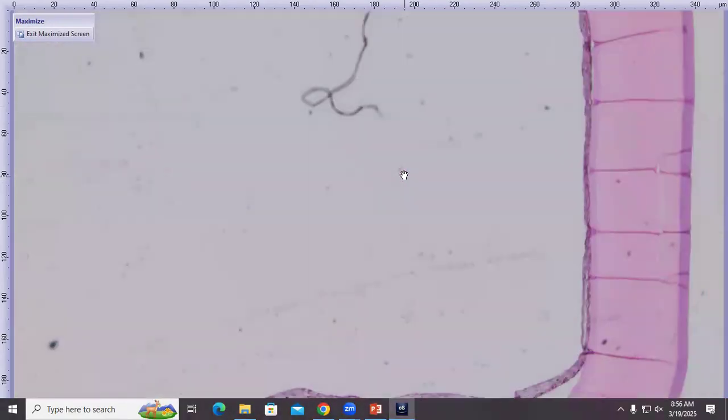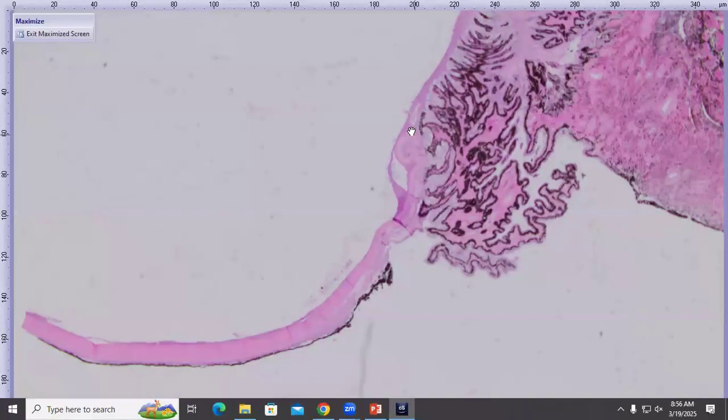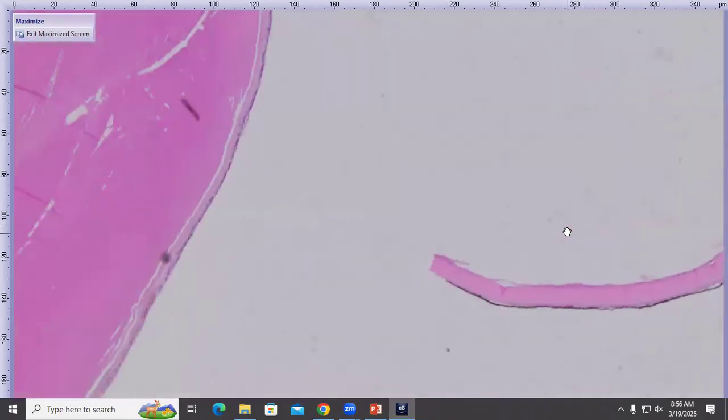If we walk all the way across to this side of the posterior chamber, you can see the other end against the ciliary body here. And even though this end of the lens capsule is fairly sharply discontinuous and sort of boxy looking, it is still curled on itself and also embedded in this membrane, which tells us that this is a real lens capsule rupture. In addition, the rest of the lens is back here.